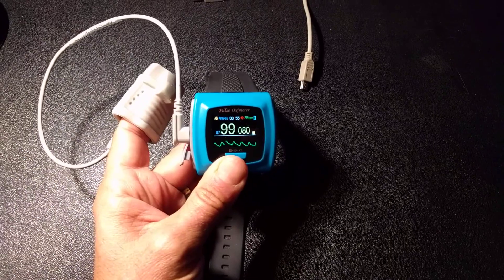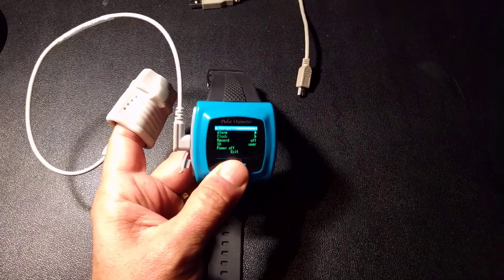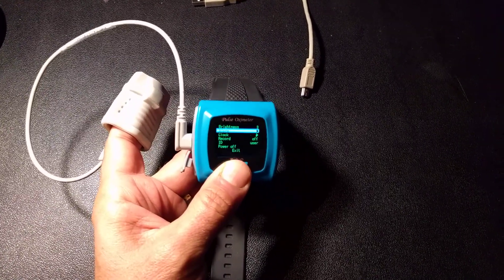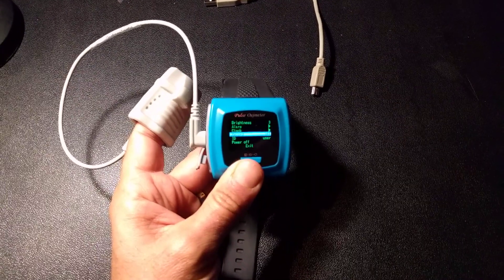Long press in record mode brings you to the menu. Toggle with short press to go to record, then select with long press.